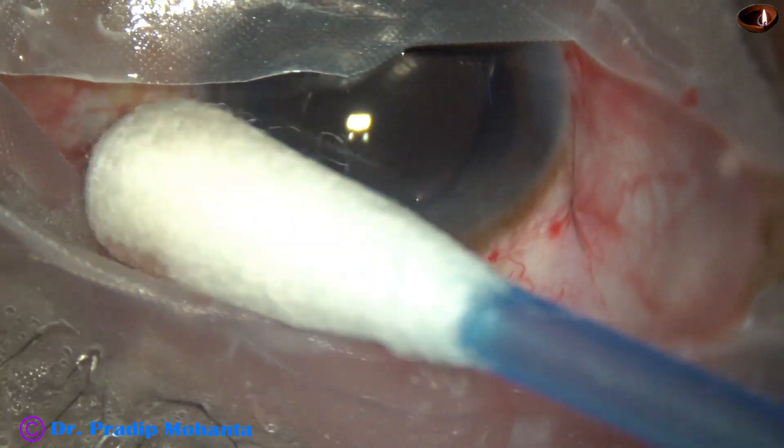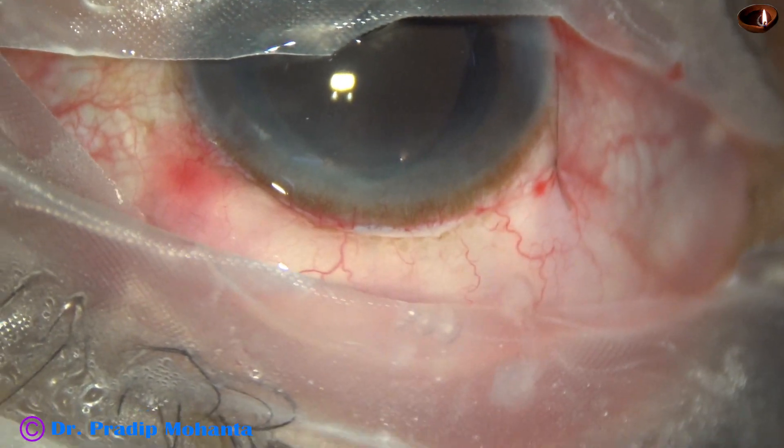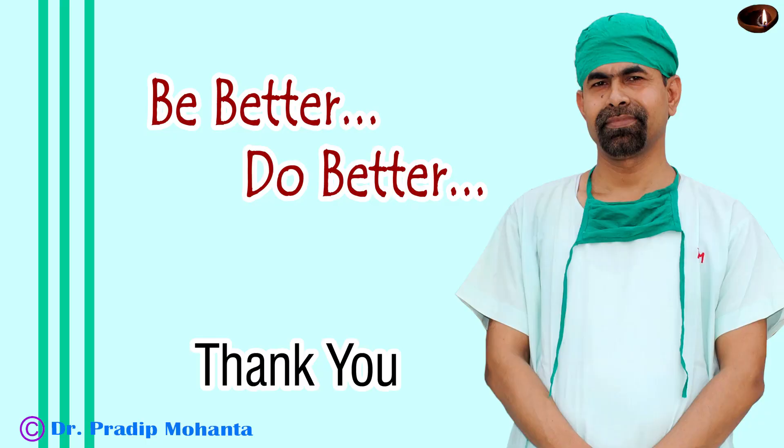So we are done with the surgery. I think anyone can do this. Thank you very much for your attention. It is a long surgery, but it is a very safe surgery. Whenever you find a patient who has only one eye and if you do not want to take the risks of phacoemulsification, and if the cataract is hard, please do this kind of safe surgery.